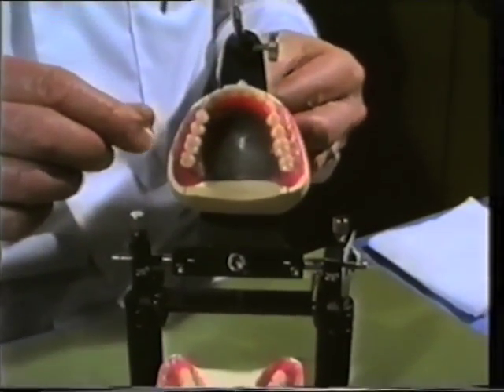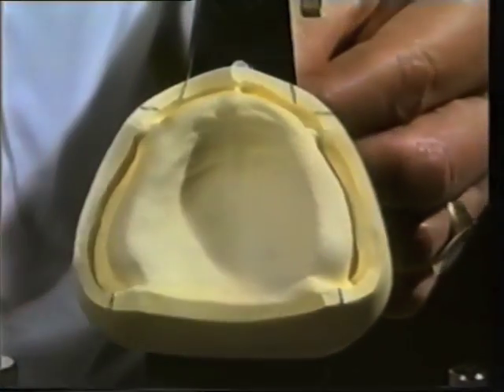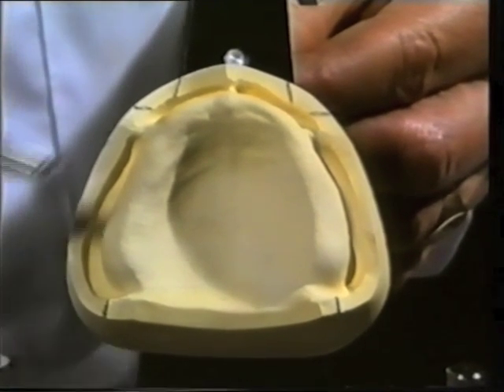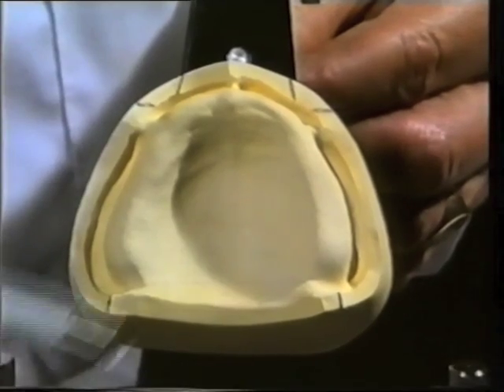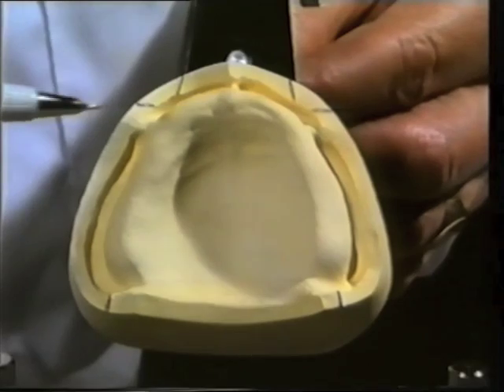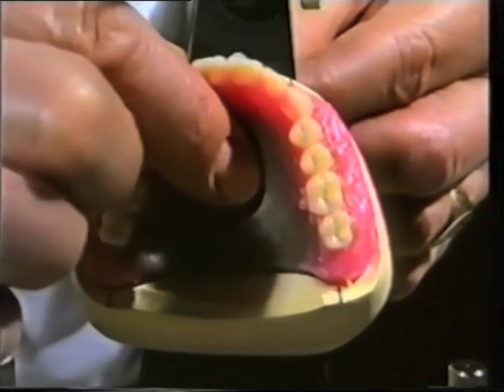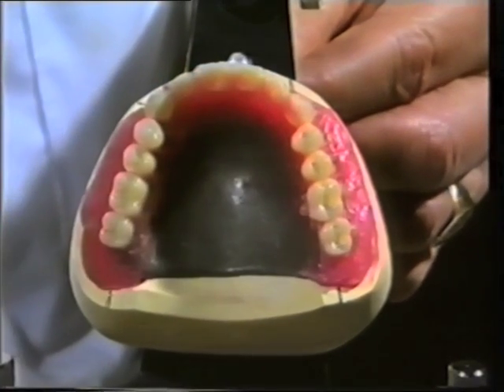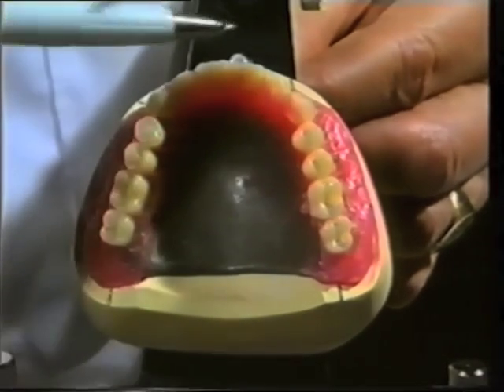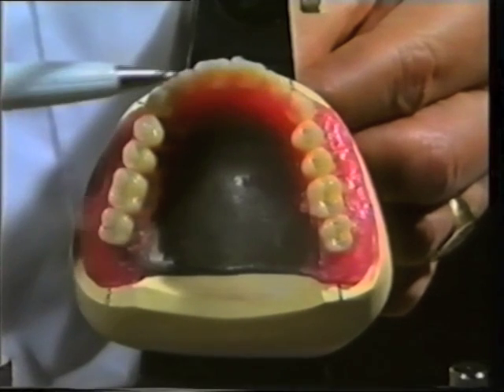The maxillary posterior teeth are set up similarly, but with one very important difference. The position of the midline of the residual ridge is again indicated. However, the palatal cusps of the posterior teeth are coincident with the midline.